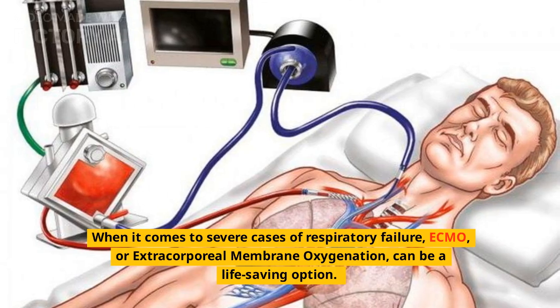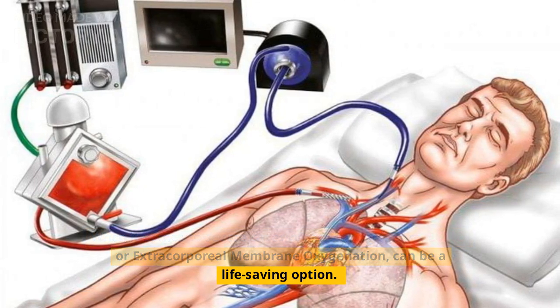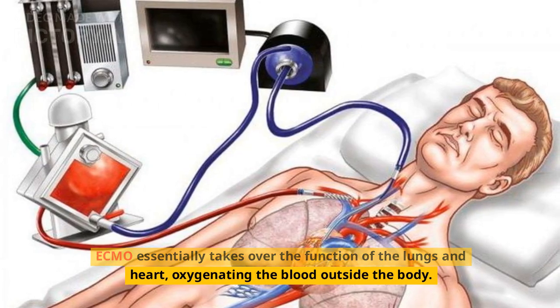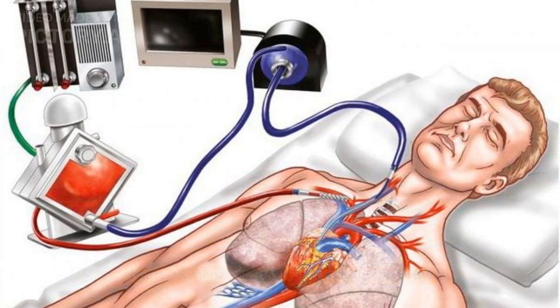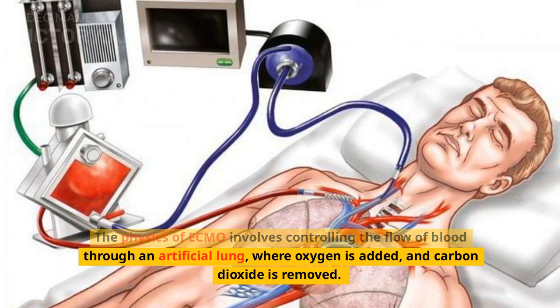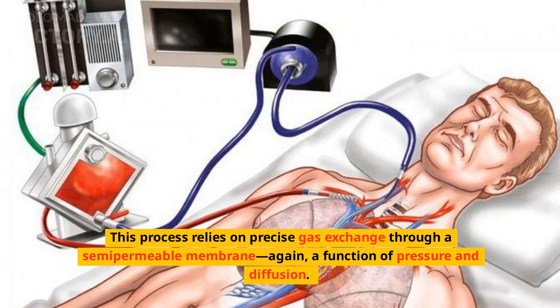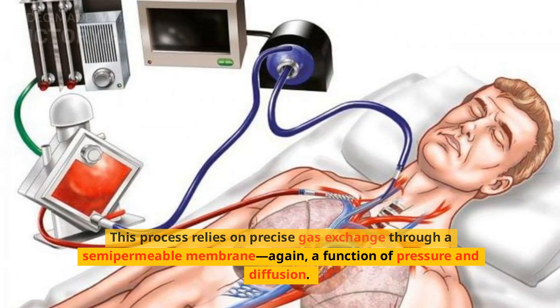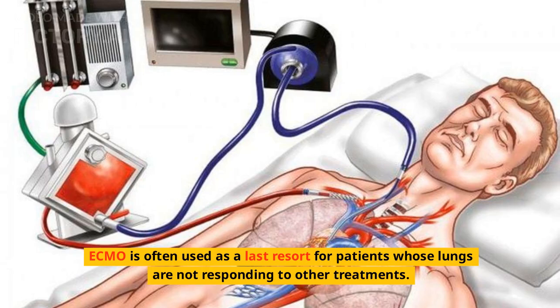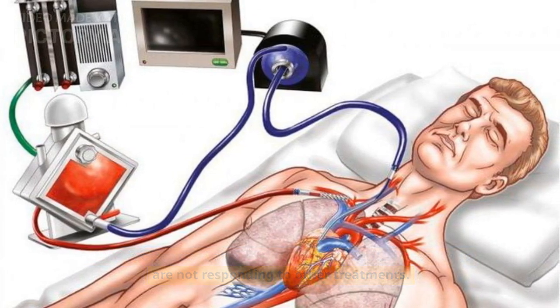When it comes to severe cases of respiratory failure, ECMO, or extracorporeal membrane oxygenation, can be a life-saving option. ECMO essentially takes over the function of the lungs and heart, oxygenating the blood outside the body. The physics of ECMO involves controlling the flow of blood through an artificial lung, where oxygen is added, and carbon dioxide is removed. This process relies on precise gas exchange through a semi-permeable membrane, again, a function of pressure and diffusion. ECMO is often used as a last resort for patients whose lungs are not responding to other treatments.